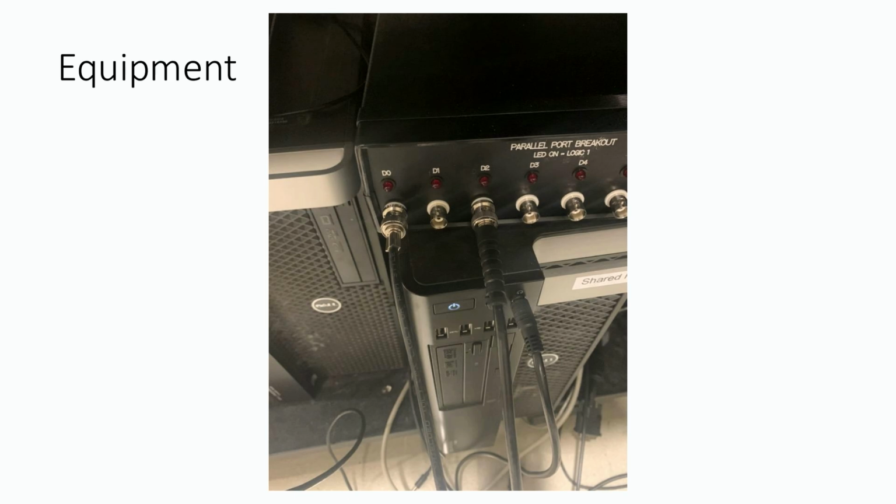I'd also say that verifying that it works is important. So after this breakout box, you can plug the cable into an oscilloscope and measure the timing and make sure that the triggers are firing properly. On the scanner side, you can do the same thing with the cable, but you can also verify, at least with a Prisma scanner that we have, there's a physio recording that shows the slice-by-slice acquisition triggers, and so we know exactly when the volume is triggered and the time between them.